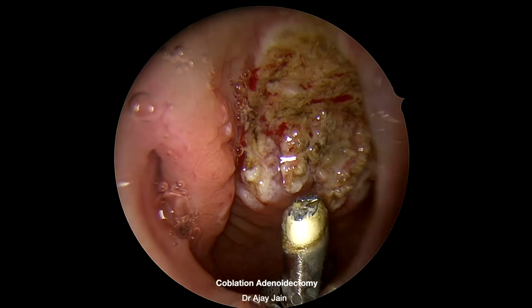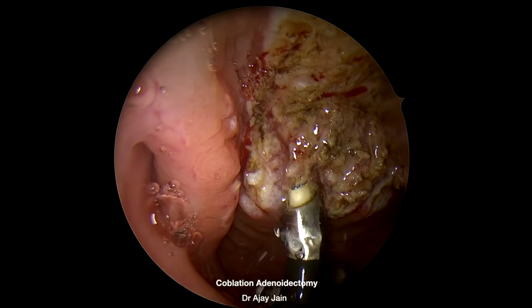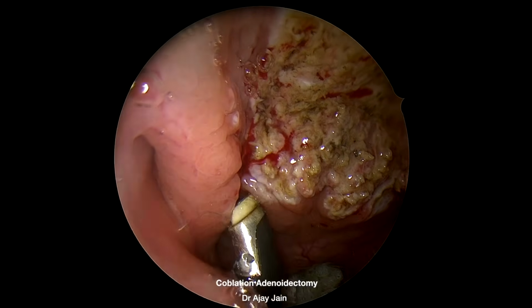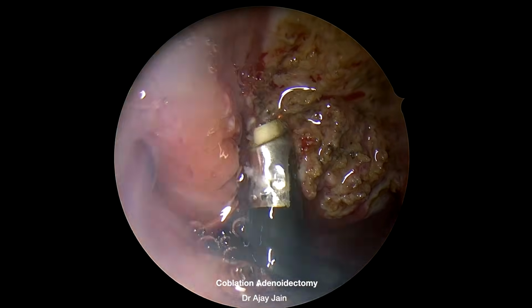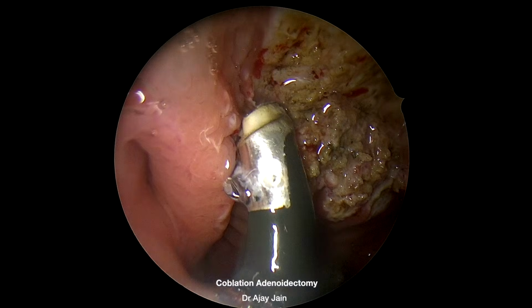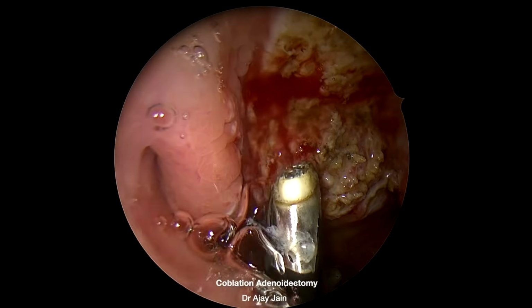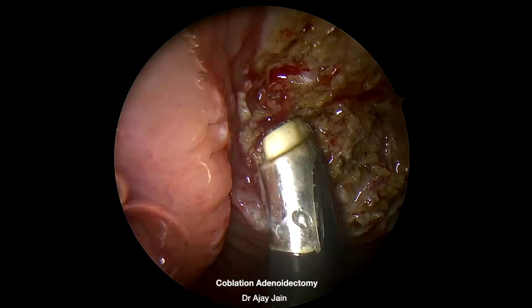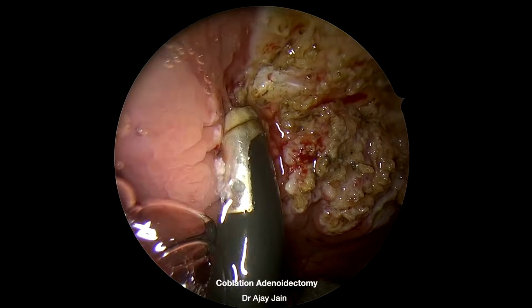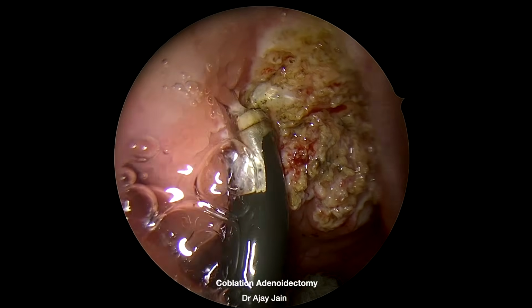Same principle, always control even the minor bleeding, and always elevate or retract the adenoid tissue, then apply the ablation, identifying the normal structures. Now a new bleeding point has opened up, no problem. So do a gentle suction, irrigate, suction, point identified, then shoot. This will stop.